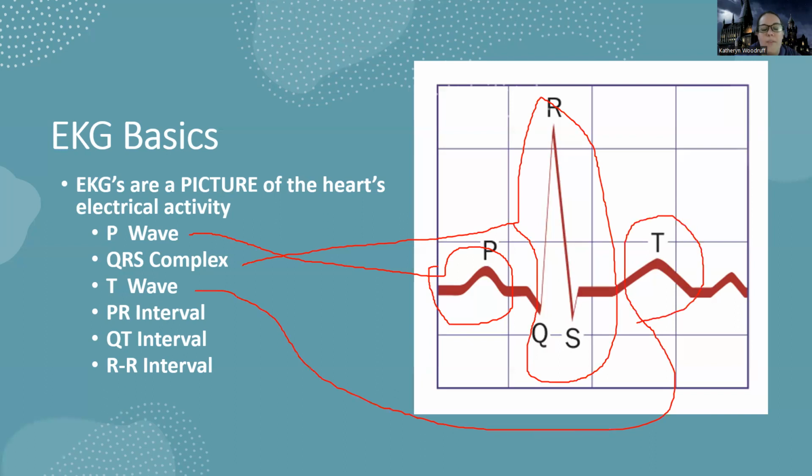We have three main waves we're going to talk about, or waves and/or complexes, and then we have intervals we're going to talk about. And you can see that the letter corresponds.